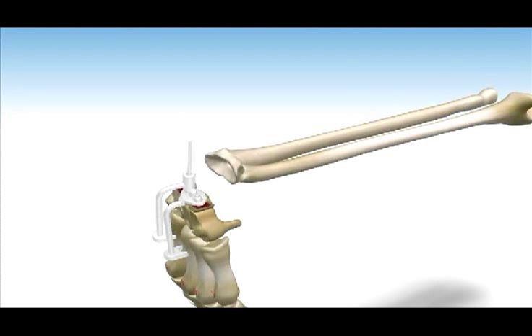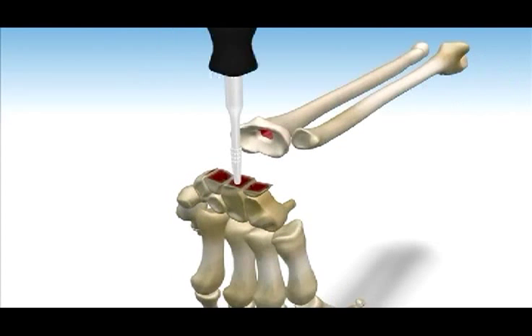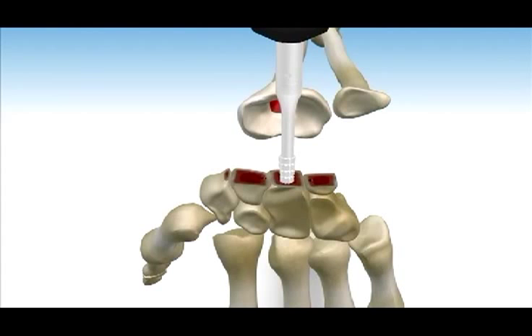Crossing the second carpometacarpal joint is an option that many surgeons prefer to do. The second carpal screw is pre-drilled through the length of the hamate but not across the fourth carpometacarpal joint. The carpal broach is used to widen the canal through the capitate. The broach has three lines which correspond with a small, medium, and large size component. Insert the broach fully to the appropriate line. The stem of the carpal trial component is inserted into the capitate. Using fluoroscopy, verify that the dorsal aspect and the length of the trial component is positioned correctly.